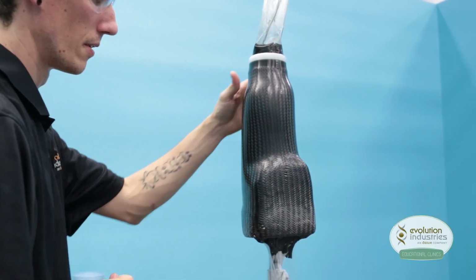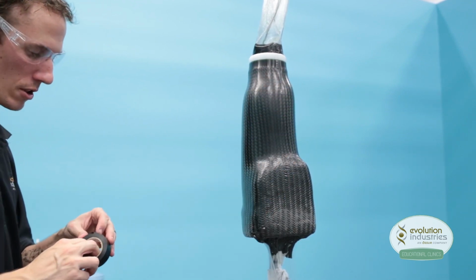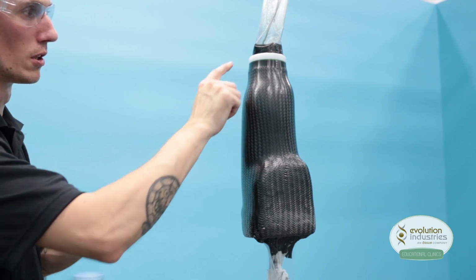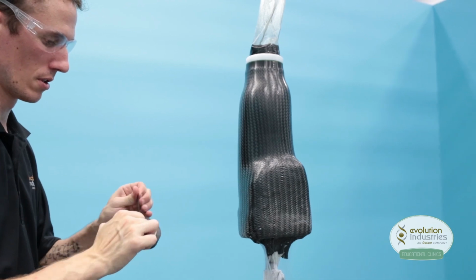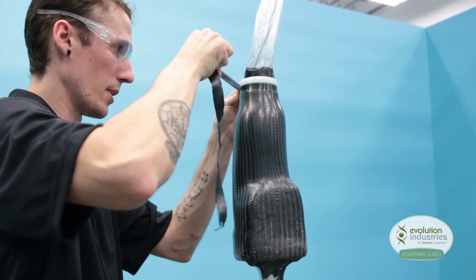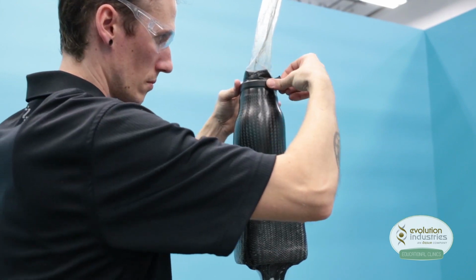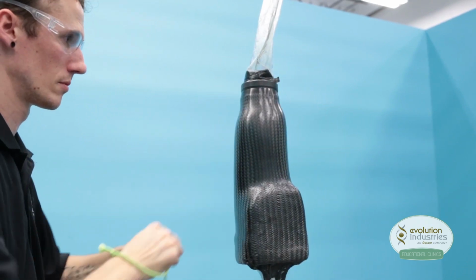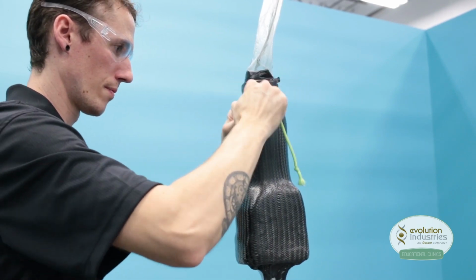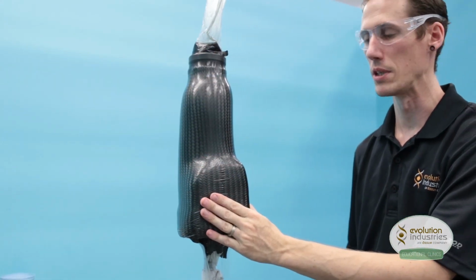Once you feel you have your socket well saturated, you can use some vinyl tape, and we will wrap around the lamination dummy, and that will also give us a nice clean edge on the edge of our plate. And then we'll let that stand for about 10 to 15 minutes to set.